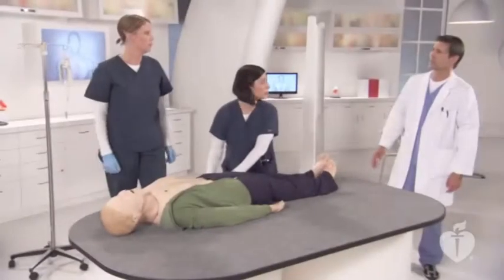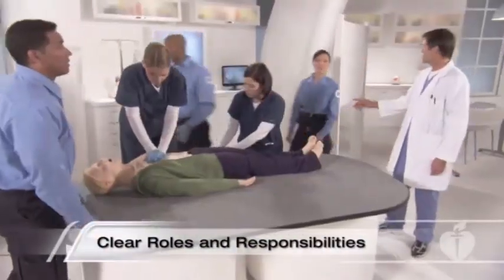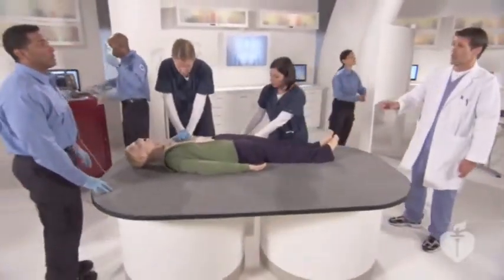The patient's gone into VFib. Start chest compressions. Starting compressions. Mandel, you'll be on defibrillator. Shelley, you'll be recording. Recording. Sam, you'll manage the airway.